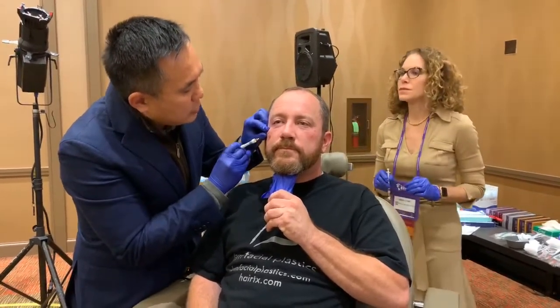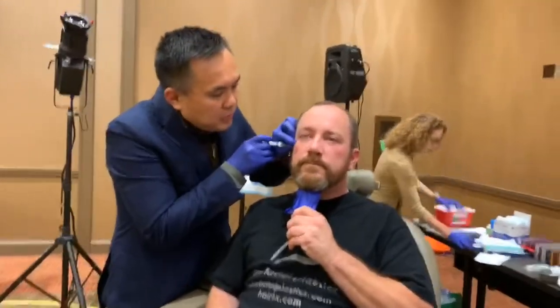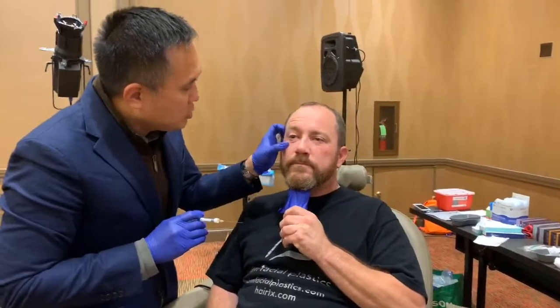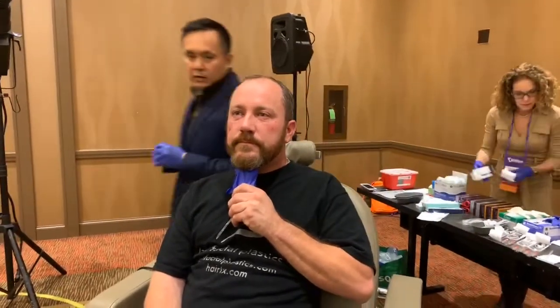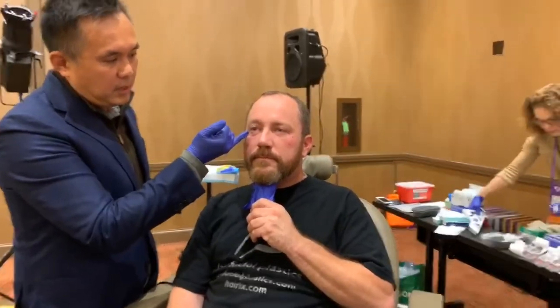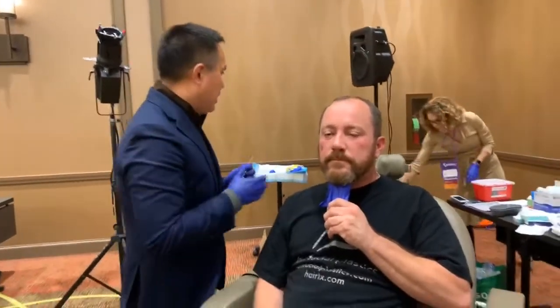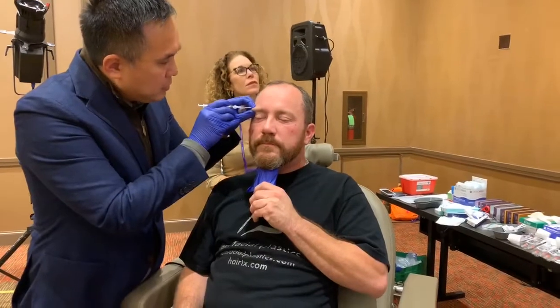I'm going to use one more Restylane and do his brows. I'm obsessed with brows. I think brows deflate, and while there is sometimes dermatochalasis or brow ptosis, the majority of aging is just the involution of the upper eyelid. Putting a little bit of volume in the brow goes a long way. You may have heard my lectures about asymmetric triangles — there's a short limb here and a long limb coming down, and that long limb looks sagging as we get older. I'm really focused on the inner brow fill, which typically just makes the eye look very youthful.